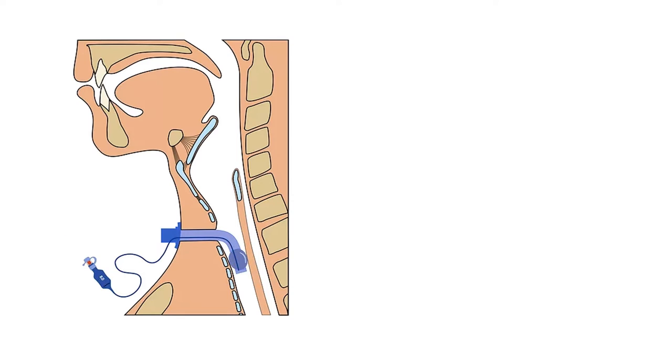Okay, so let's go into a little bit more detail before going into the emergency cases for trach patients and laryngectomy patients. So this is the tracheostomy patient with a tracheostomy kit in their airway. This is a cuff. This is what you call the outer cannula. And inside there is an inner cannula, oftentimes, not always, but oftentimes, and that will usually help with mucus. Then there's a cuff. They don't always have a cuff, and we'll get back to why in a little while.